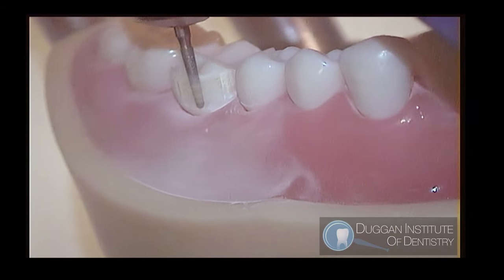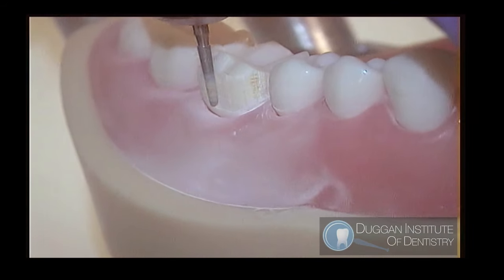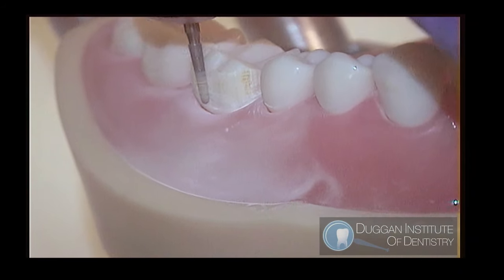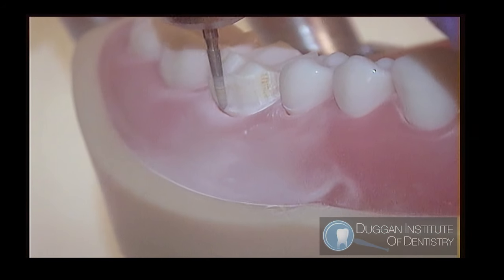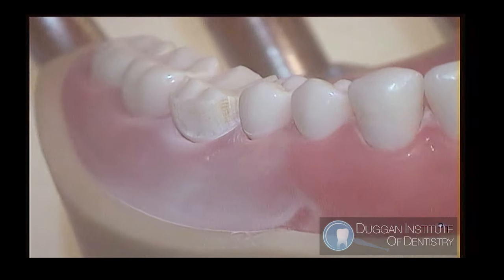The burr has a natural tapered shape that will give us a 3-degree taper. Keep the burr vertical to the long axis of the tooth. You may also take the angle from the middle third of the adjacent tooth. Gently reduce by rounding the axial surface. Be careful not to taper or tilt the burr away from the axis of the tooth.